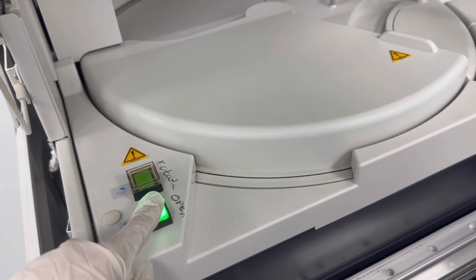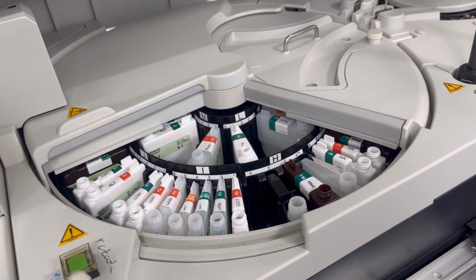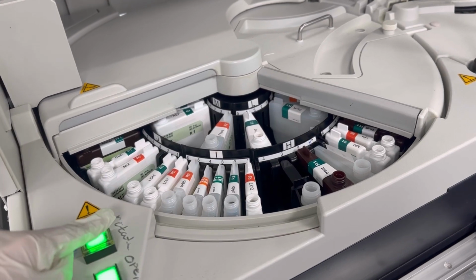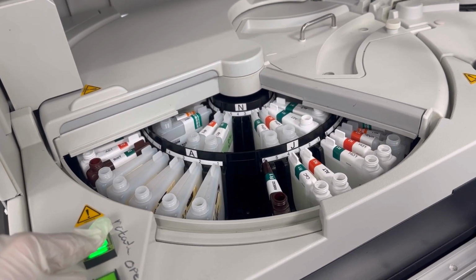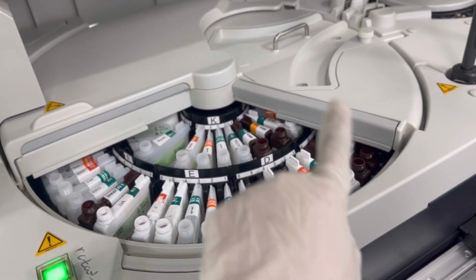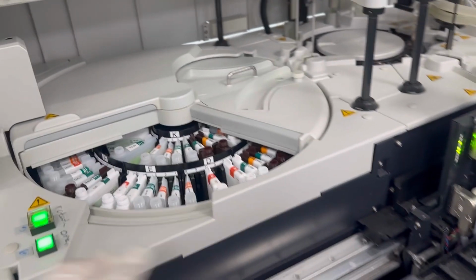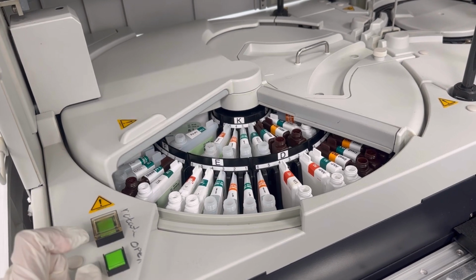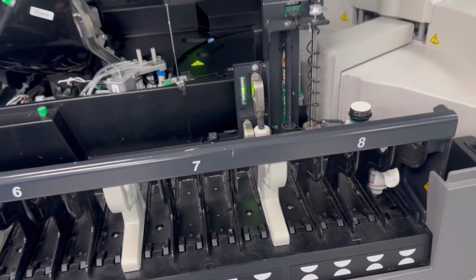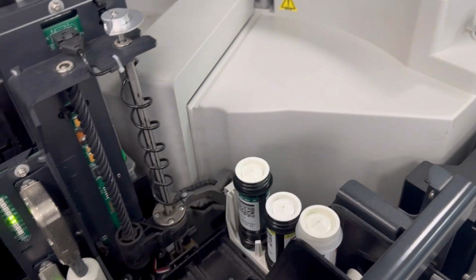Next moving on to this one, this is the chemistry part. Here we have two buttons, one is for open and the other is for rotate. If you open, the machine will open here on the chemistry side, and these are all the reagents which you can see for the chemistry. If you want to rotate, you can rotate it and replace the reagents when they are empty. These are all the chemistry side reagents. Okay friends, I think now you are done with the chemistry part. Now you can close it, and this is done.